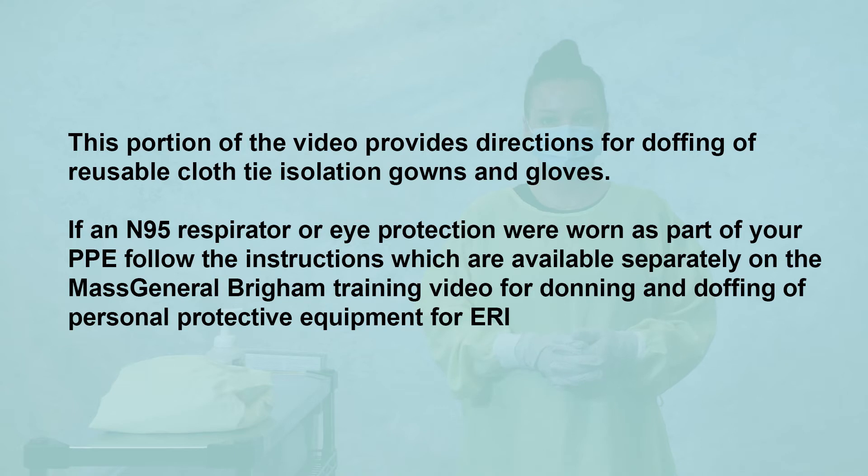This portion of the video provides directions for doffing of reusable cloth isolation gowns and gloves. If a N95 respirator or eye protection were worn as part of your PPE, follow instructions which are available separately on the Mass General Brigham video for donning and doffing of personal protective equipment for ERI.